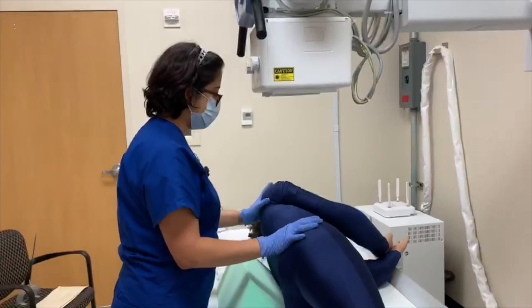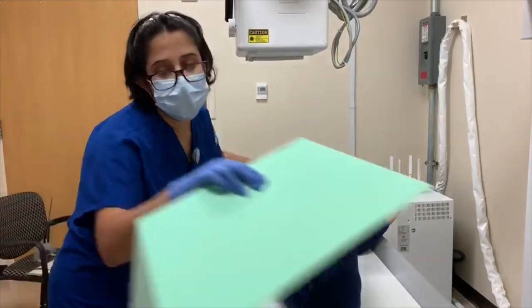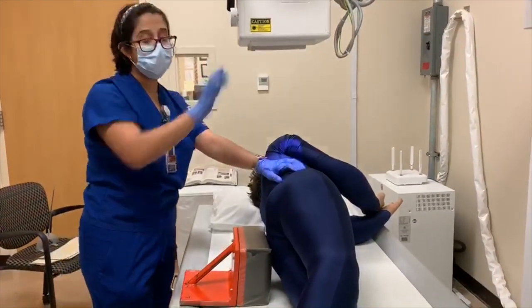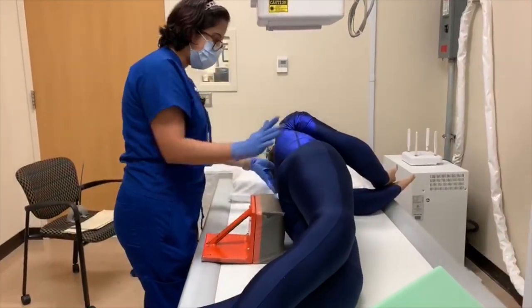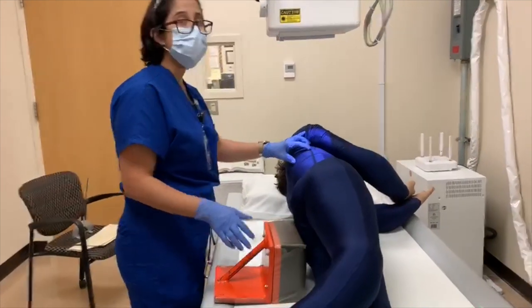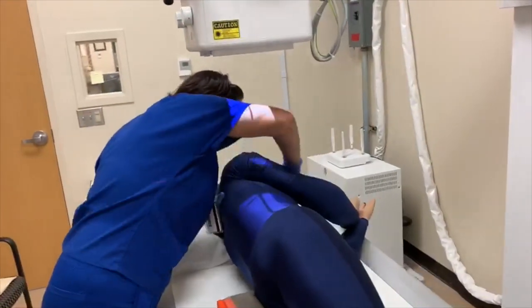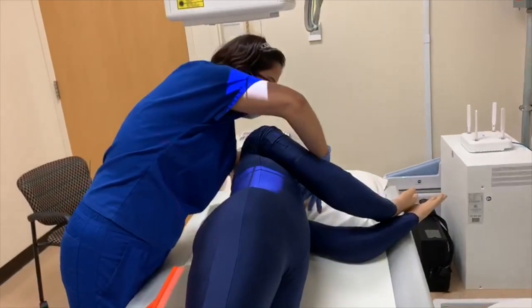So you just roll her back into the lateral. On Molly, we use a weight just to try to maintain her position. On a patient, they can help you out for the most part. Just make sure she's there. Your centering is going to be 3 to 4 inches below the jugular notch, so just make sure that that CR has been maintained throughout your rotation.